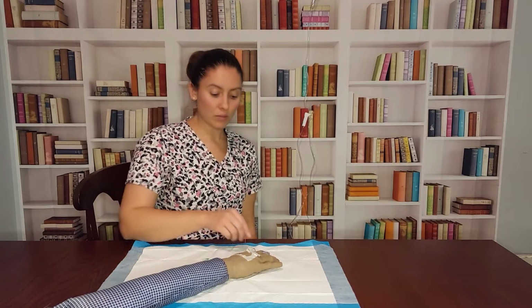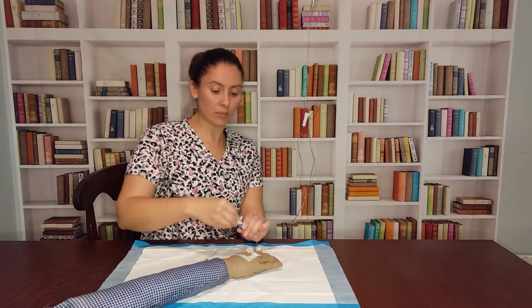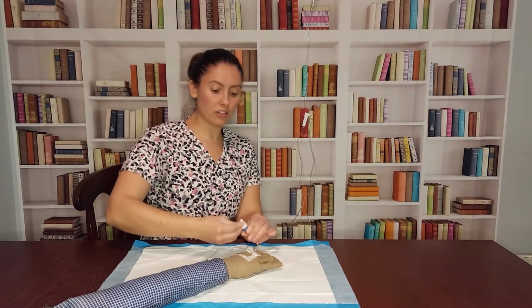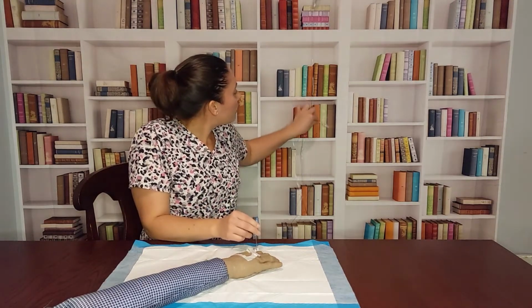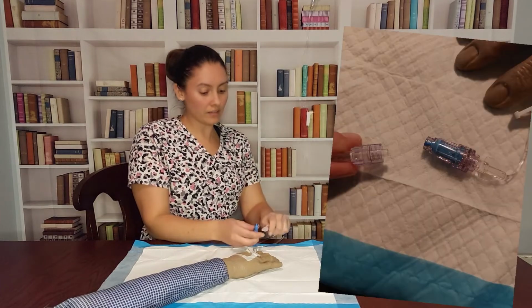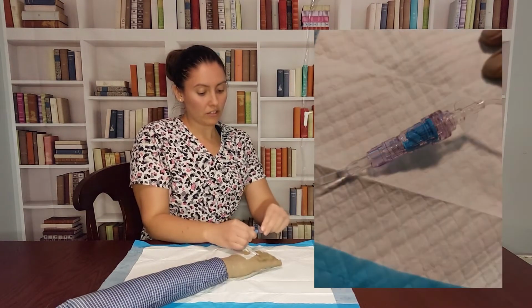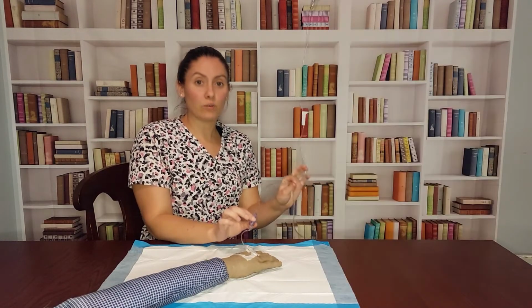Now that we have our patient and our IV prepared, we just have to hook the two together. We start by alcoholing the end of our blue stopper once again. You always want to make sure this is clean before you hook anything to it. You're going to grab your IV line, take off the cap, and hook the two together. And now your IV is ready to run.